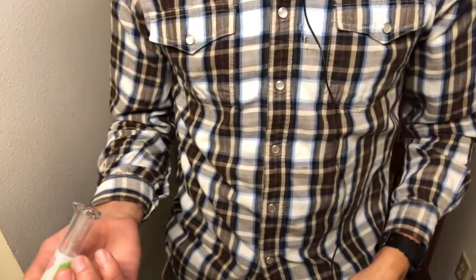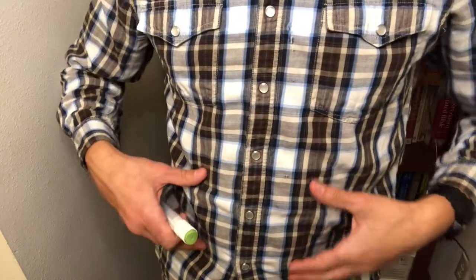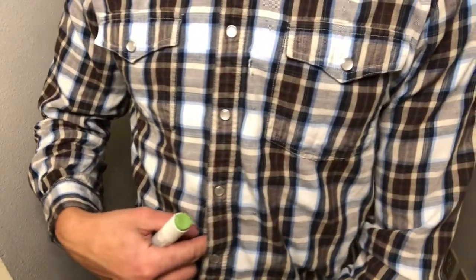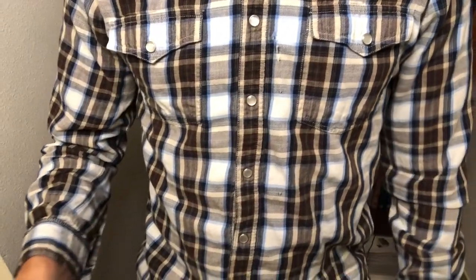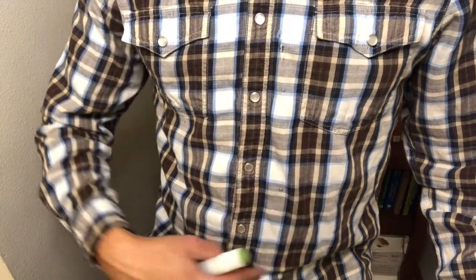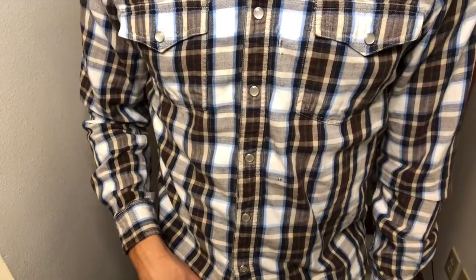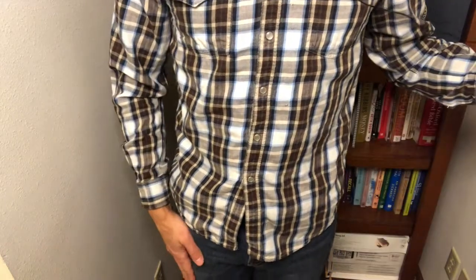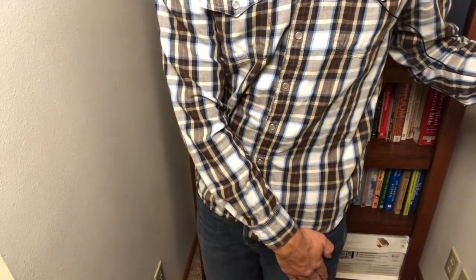The most common place, honestly, is going to be the abdominal region. So anywhere around the belly button is going to be an okay place to inject. So anywhere in this area. Another place that you can inject are the thighs, here and here.